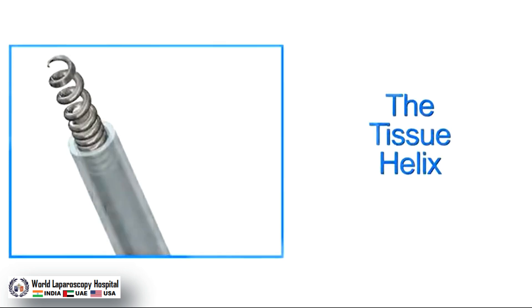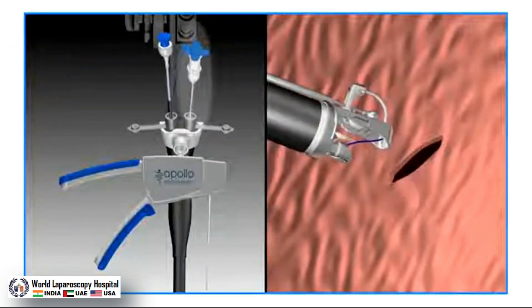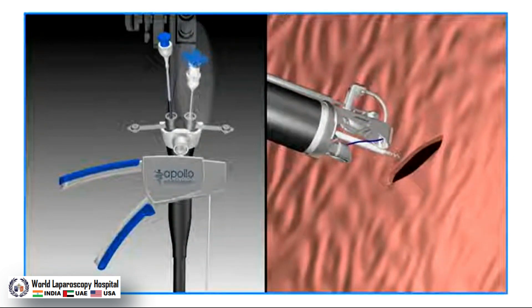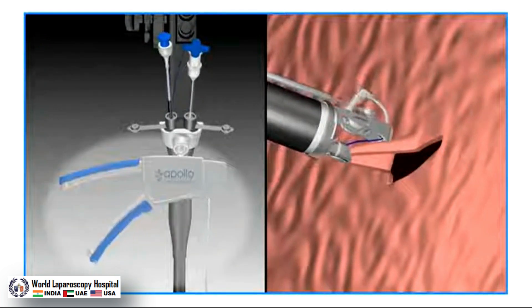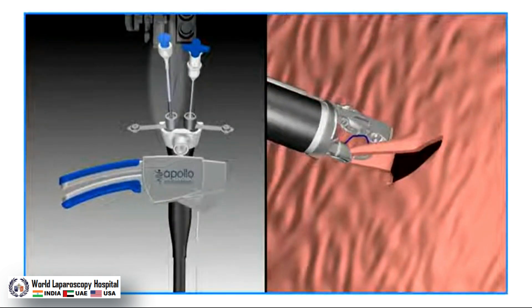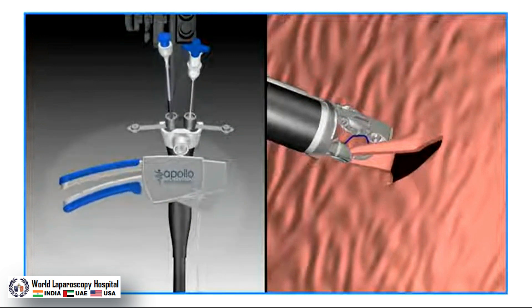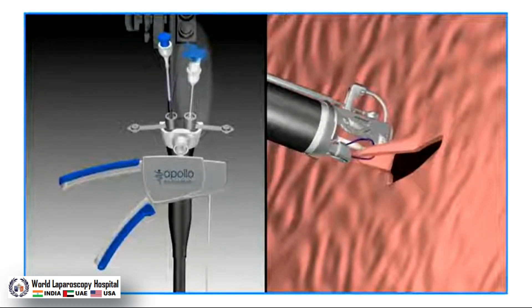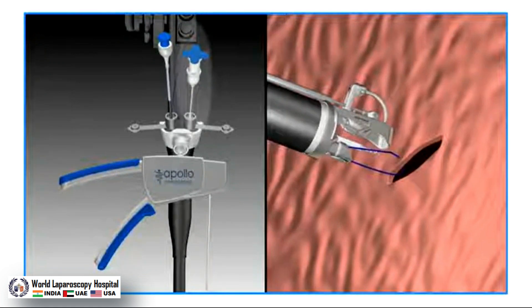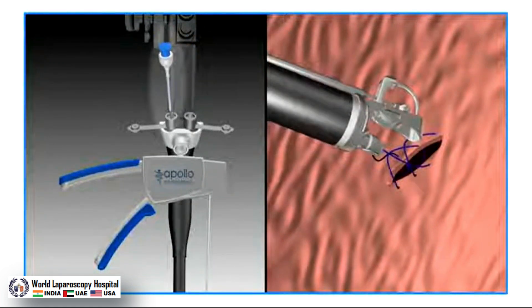The helix is designed to grasp and manipulate tissue. After passing the helix through the secondary channel, unsheath the helix by pressing the blue rotation knob and then rotate the knob three to four turns clockwise. With the tissue captured, the catheter can be pulled to draw the tissue into the suturing arm. After the stitch is placed and needle arm retracted, the helix is unwound by twisting the blue knob counter-clockwise with slight backward tension. This process is repeated to place additional bites. A variety of stitch patterns can be created, including interrupted or longer running stitch patterns.